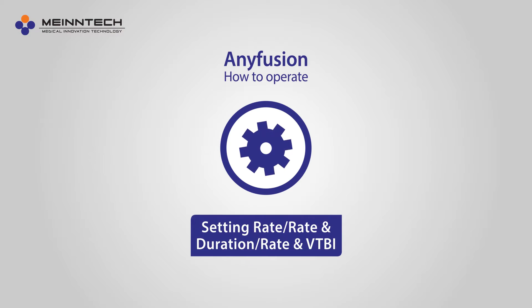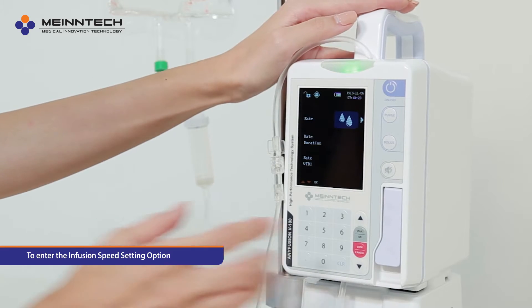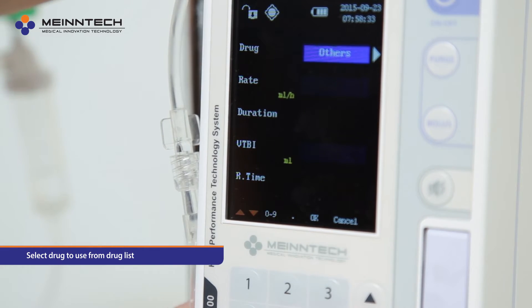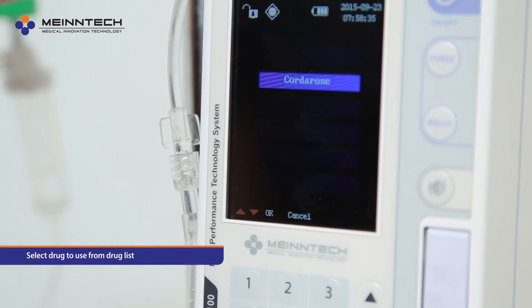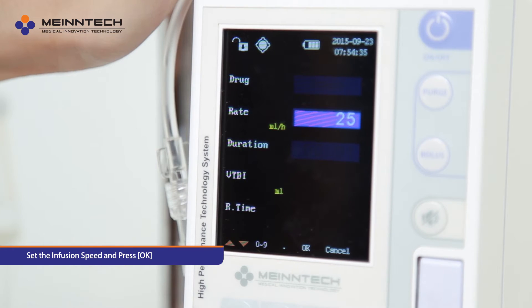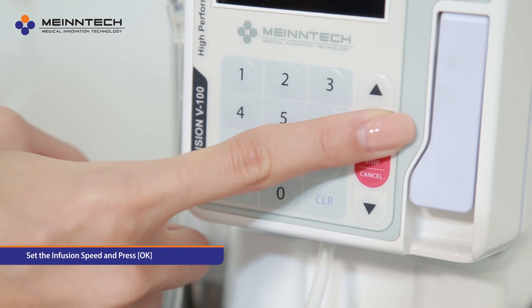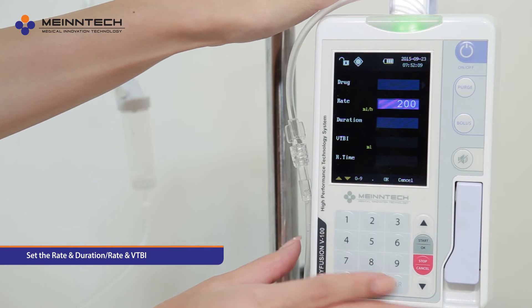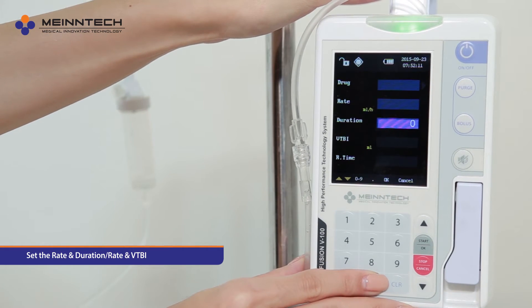Step 2: setting three different modes — setting rate, rate and duration, and rate and VTBI. Select rate to enter the infusion speed setting option. Use the numerical key to set the infusion speed and press OK to complete the setting. Set the rate and duration, and rate and VTBI with the same process.